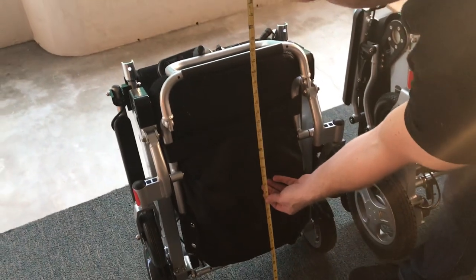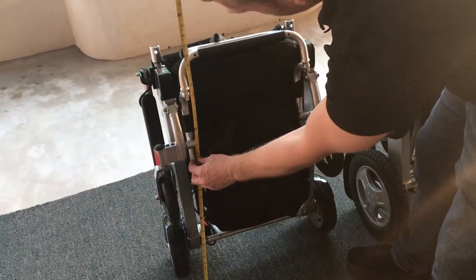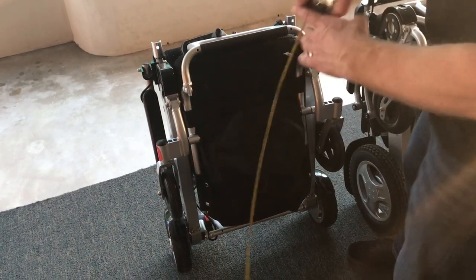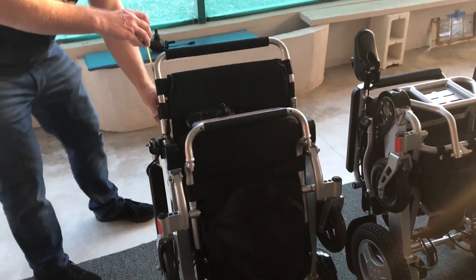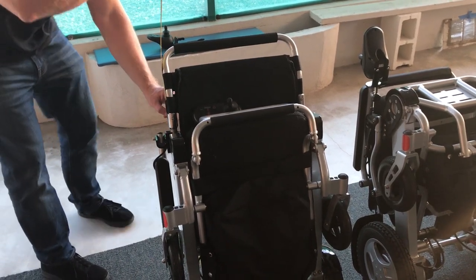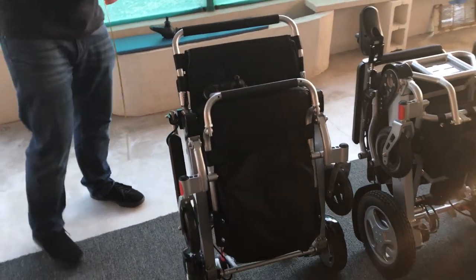For height, let's take a look — approximately 32 to 33 inches. And if you lift the back of the chair up, right at the three feet mark. These are all approximates; everyone can measure a little differently.